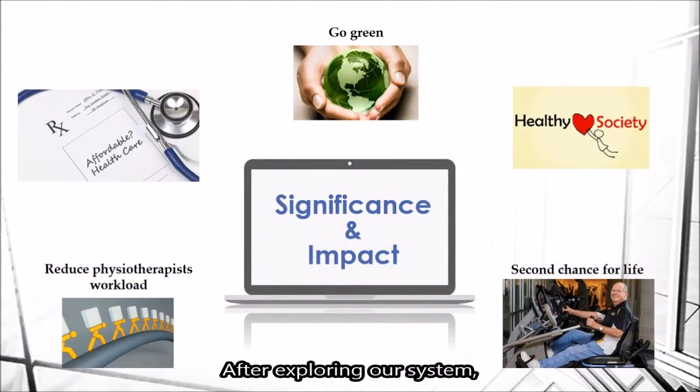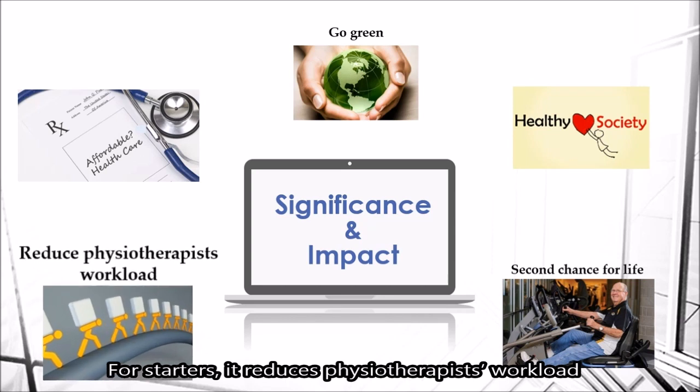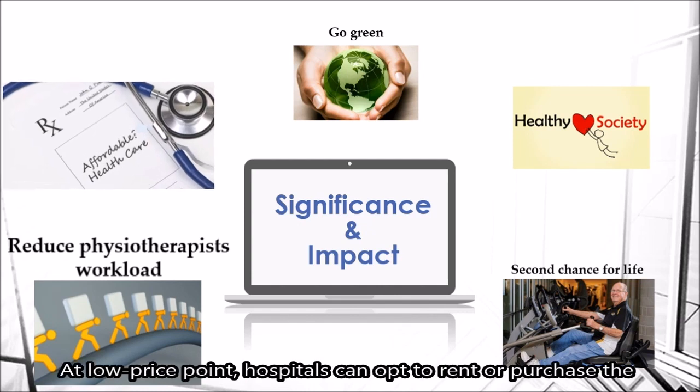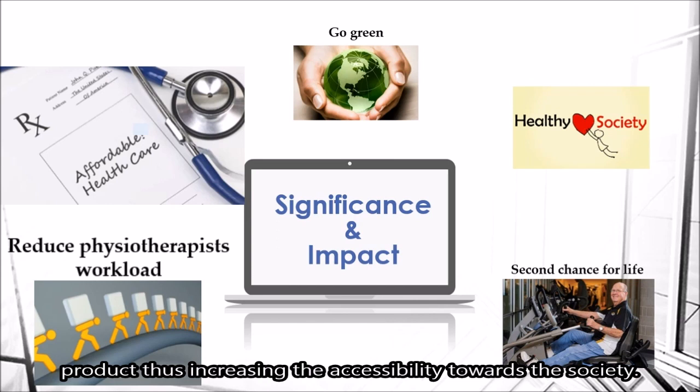After exploring our system, how can it actually impact our society? For starters, it reduces physiotherapists' workload as repetitive tasks are replaced by the machine. At low price point, hospitals can opt to rent or purchase the product, thus increasing the accessibility towards the society.